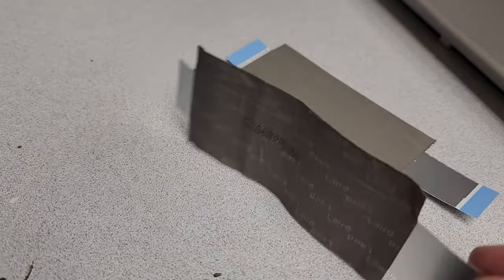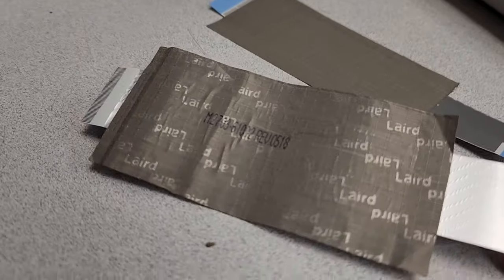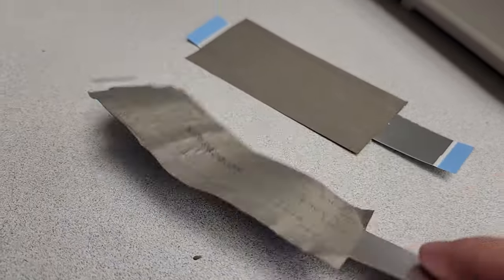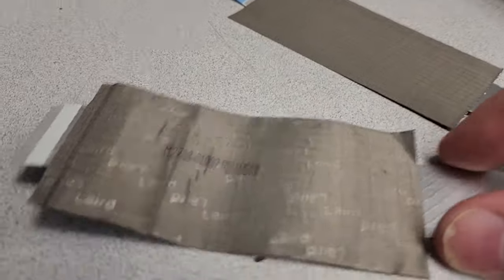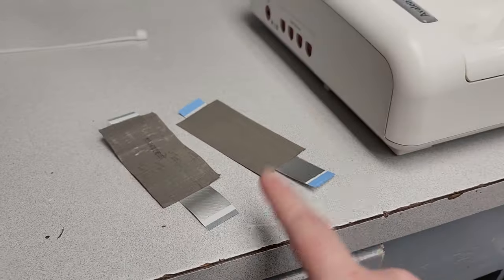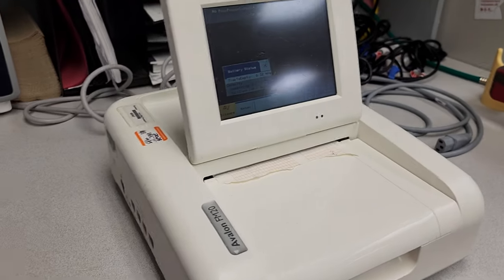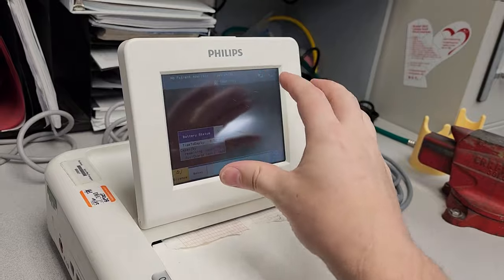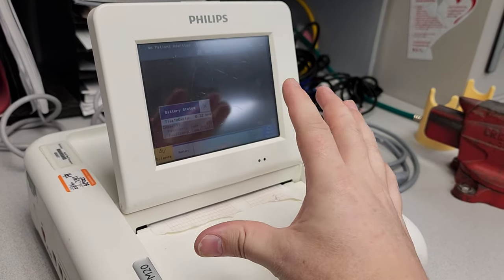Take a look at this. It honestly doesn't look bad. And normally with ribbon cables, you can kind of see when the lanes are damaged. But this guy here, because of the shielding, it's really hard to tell. When in doubt, always change out parts that interface with the user. That is where they're going to break. Now, it's very unlikely, if you don't see any signs of physical damage, that the display is actually broken.